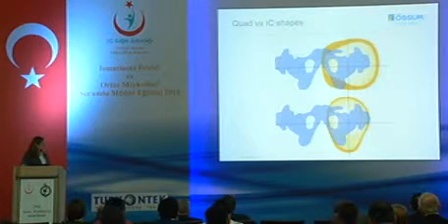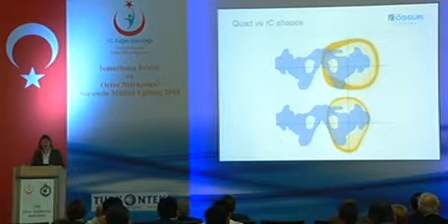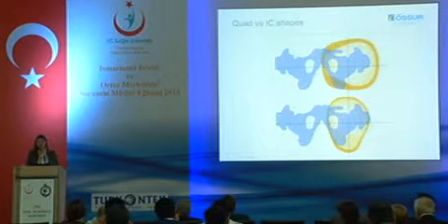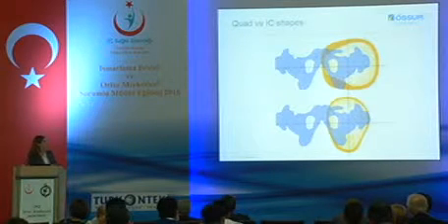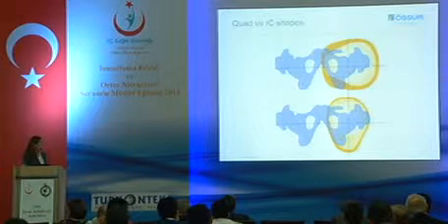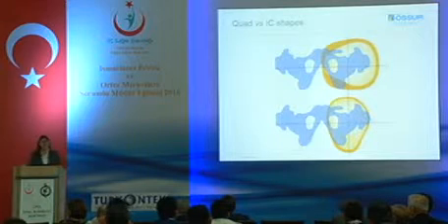Whereas with the IC socket, what we see is a much more anatomical shape, making the anterior posterior wider than the medial lateral shape. İskial containment sokette ise mediolateral daha dar, anteroposterior olarak daha uzun ve anatomiye daha uyumlu bir soket şekli görüyorsunuz.